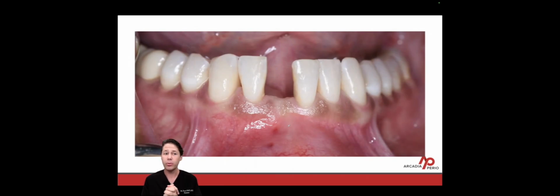So here we are, ready for surgery with implant placement. So let's talk about incision design. Here we have good adequate tissue, good bone. Now remember, I'm going to remove that tack in the midline. I'm going to leave those two tacks apical near the canines.